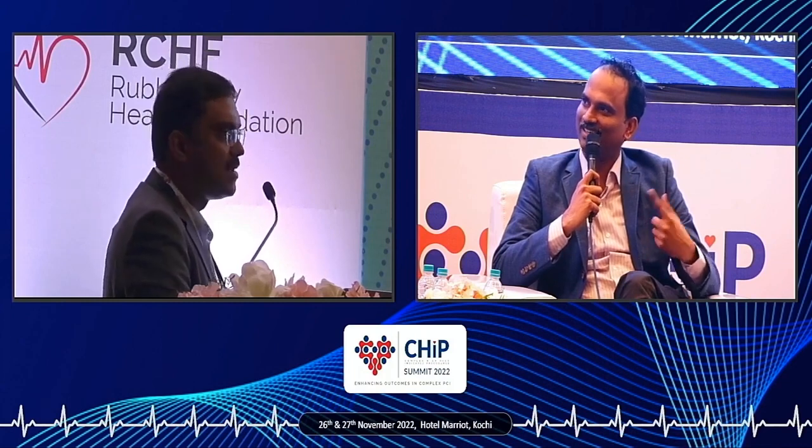You mean to say post LMCA PCI with restenosis? No, if the patient gets restenosis, do a laser and a drug-eluting balloon; again restenosis, do a laser and a drug-eluting balloon.